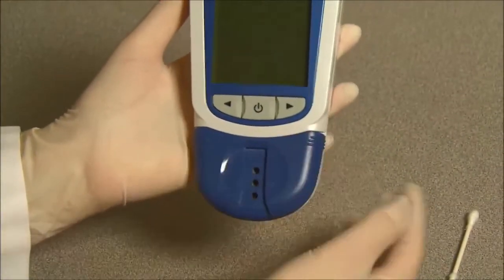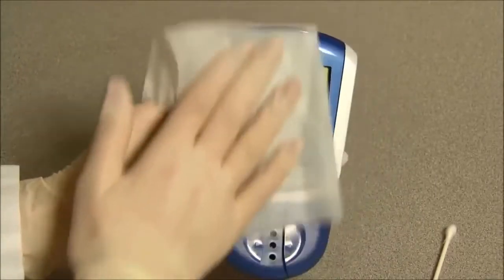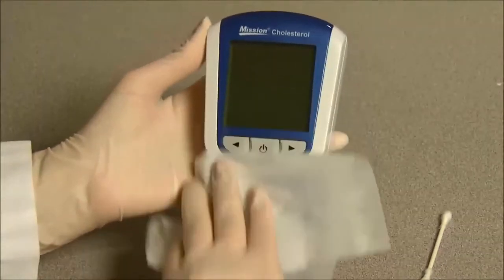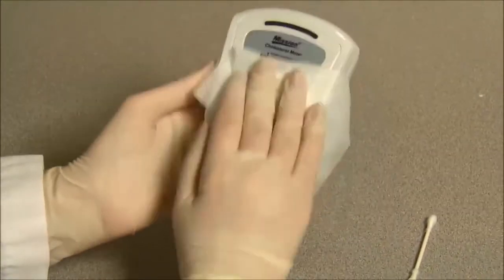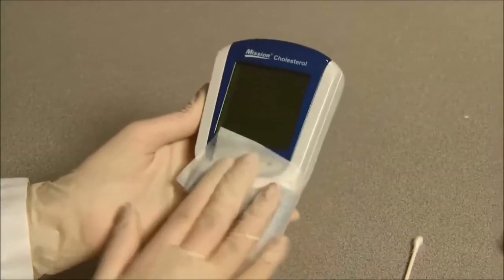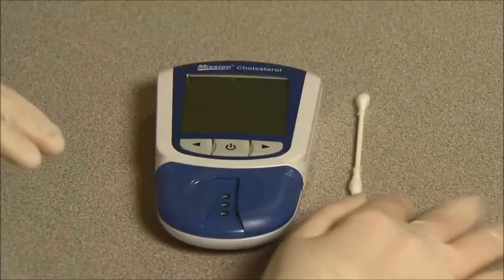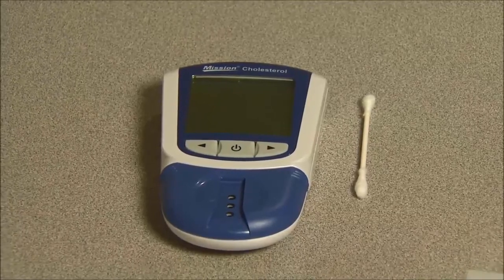Slide the test device holder back into the meter. If the meter is used for testing on multiple patients, it should also be disinfected before each test to prevent potential infectious disease transmissions through blood-borne pathogens. For disinfection, please use EPA-registered wipes with active isopropyl alcohol to wipe the meter. Be sure to wet the entire meter surface thoroughly and remove any stains or debris. The meter surface must remain visibly wet for one full minute, then allow the meter to air dry completely before using it again.